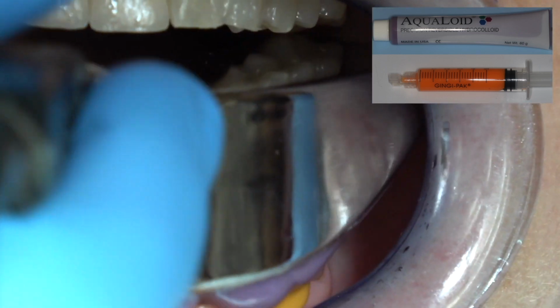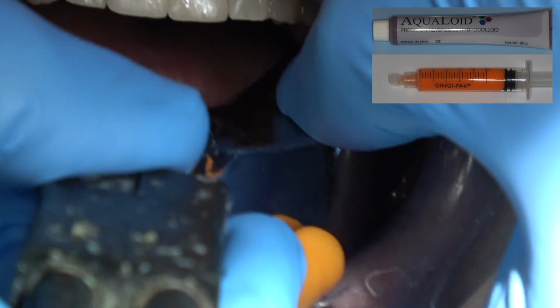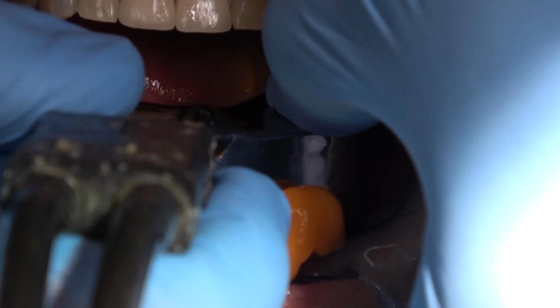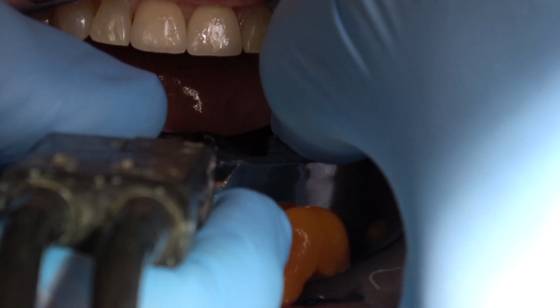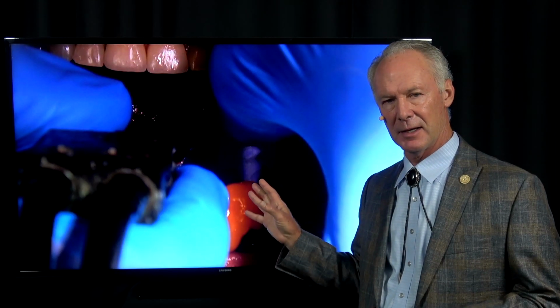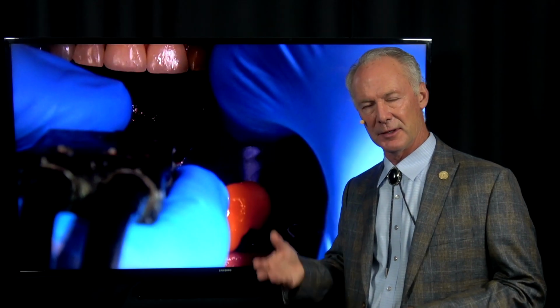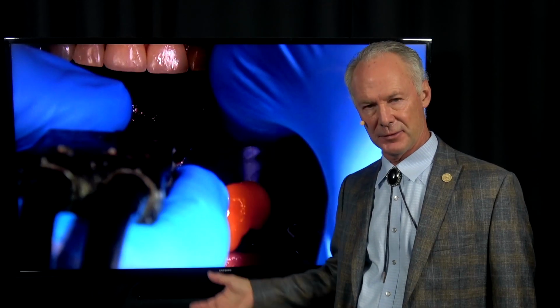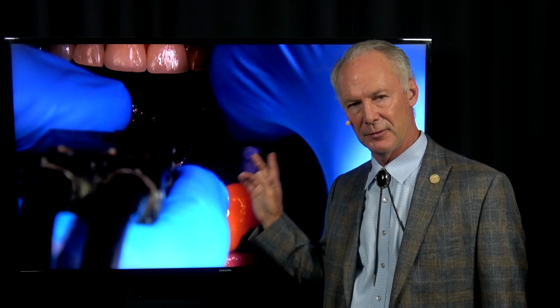And I always take 2 impressions, just because I never want to have to make that call to a patient if there was something on the impression that I didn't see and I need another one. This way you've always got a backup. For 40 years I've always taken 2. Now, reversible hydrocolloid is very inexpensive. It costs about $1 an impression. So sometimes if I do 2 or more crowns, I'll take a polyether with custom tray and a reversible hydrocolloid impression. If I'm doing a single restoration, I take 2 reversible hydrocolloids, but I always have that backup.